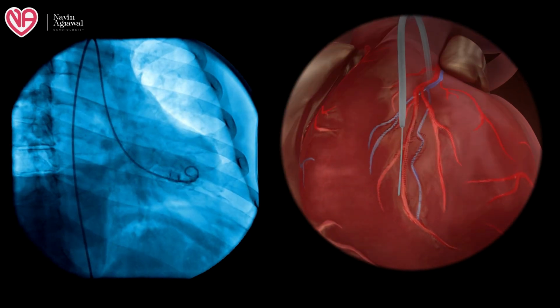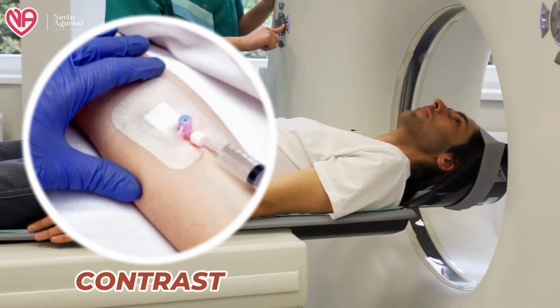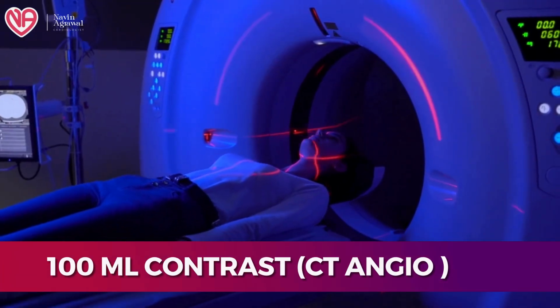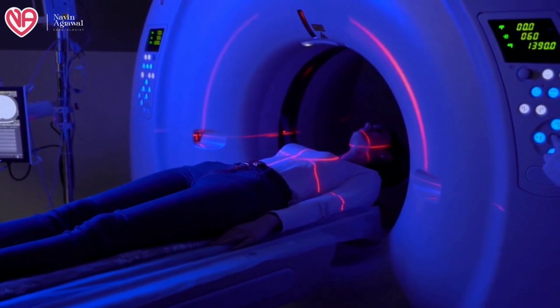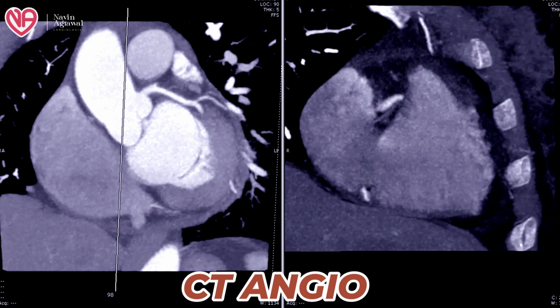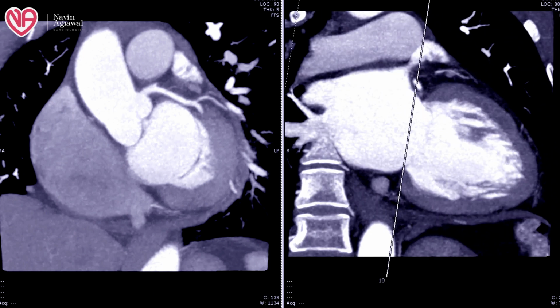In CT coronary angio, the disadvantage is that it involves the use of a larger amount of contrast. In regular catheter angio, we use only 10 to 20 ml of contrast, while in CT coronary angio, we use almost 100 ml of contrast. So the amount of contrast used in a CT coronary angio is on the higher side, and the image quality obtained is less reliable as compared to that of a conventional catheter angio. These are the basic differences between a CT angio and a coronary angio.